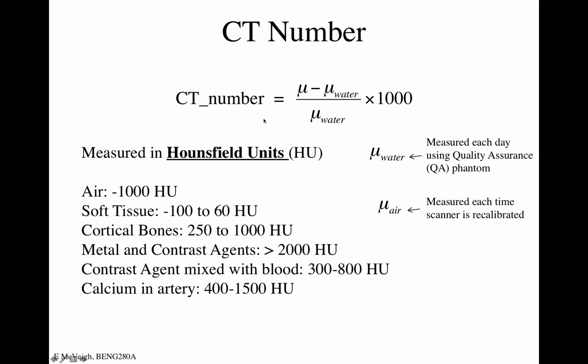And so the CT number, or the Hounsfield unit, that is displayed on the screen is equivalent to the mu value of that pixel minus the mu value of water, divided by water. So it's the fractional difference of that pixel from water times 1,000. And the 1,000 is just so that I can make integers and encode this into an integer picture. So the levels are integers.